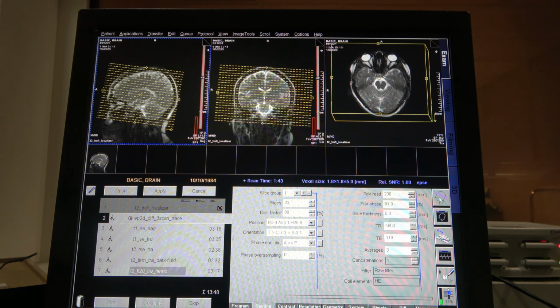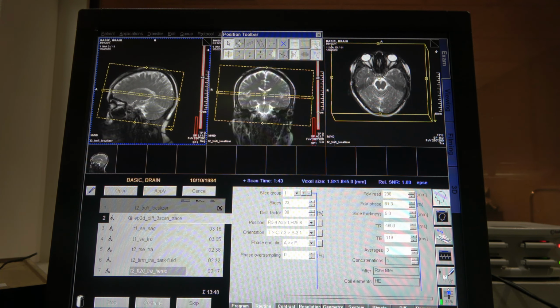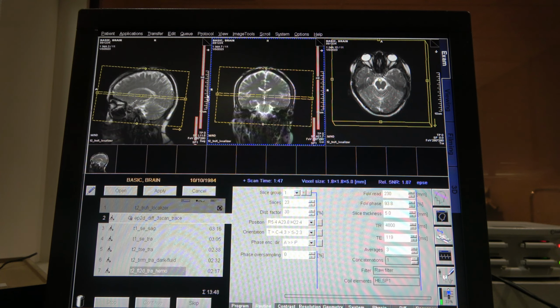I like to change that, and I like a full-on square or rectangle. Now these bars you see here, these are the coils. All right, gray, this is non-select, so this is not a selected coil here, and it's the head coil. We want that on.